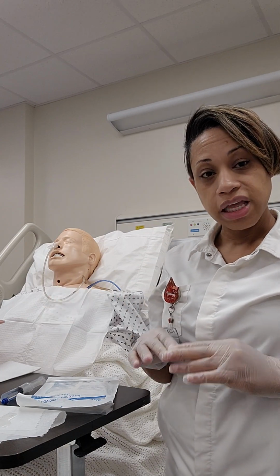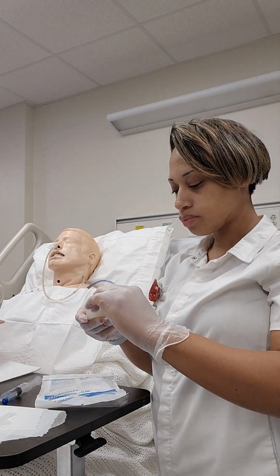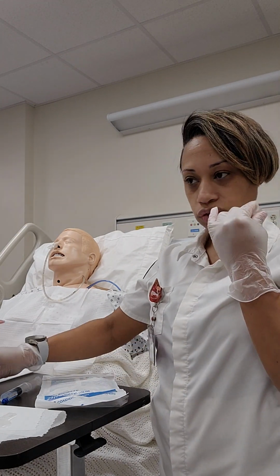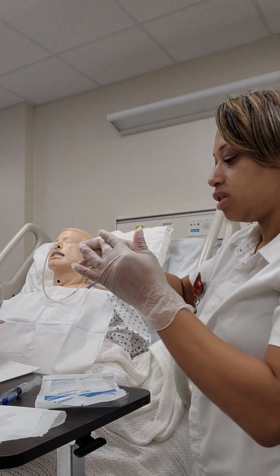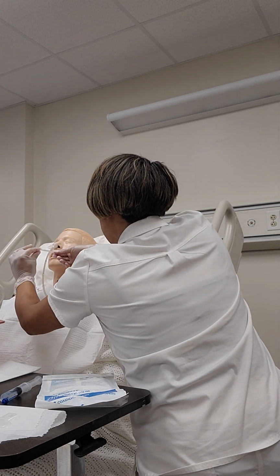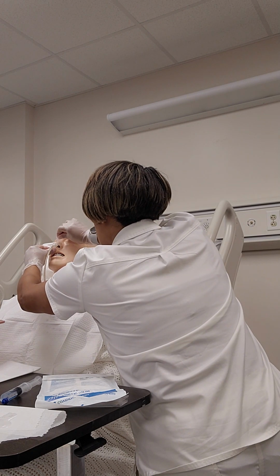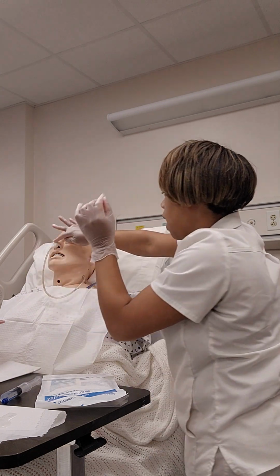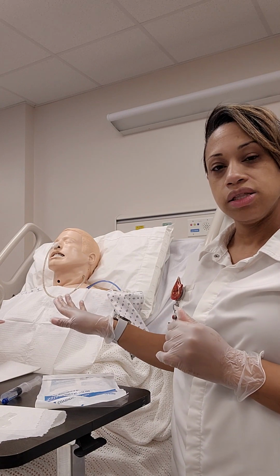Once I have confirmed placement, I will secure the tubing permanently. Sometimes they'll have a little device that connects to the tubing where you can tape it to the client's nose, but since I don't have that, I'm going to use tape. Okay. So now that I have it secure, I know that it's in the right spot.